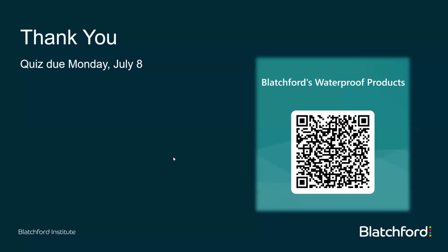For waterproof components, are they okay for extended chlorine use? That's not something we really recommend. Chlorine's pretty corrosive. However, if you were to wear it and rinse it really, really well, as long as it's mechanical, especially the Echelon, the Avalon, some mechanical waterproof, that would be more okay. The microprocessor stuff, chlorine's corrosive, so we want to be careful with it. But again, you could rinse it and it would probably be okay. But officially, it is a non-chlorinated usage.